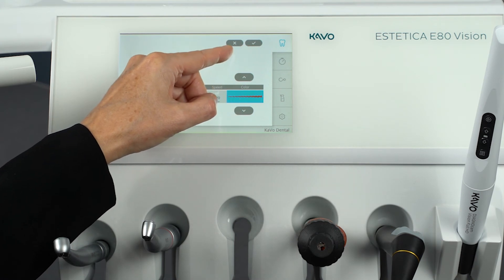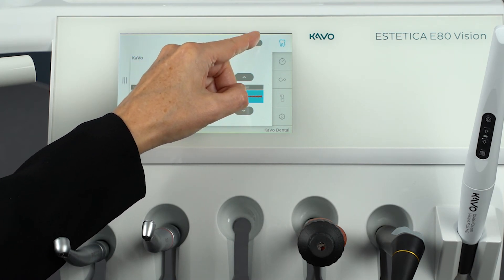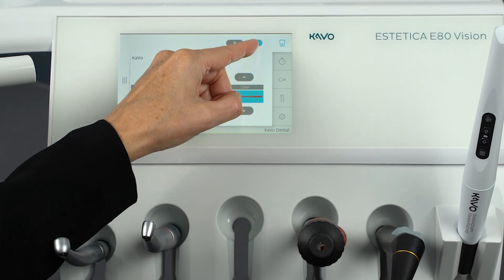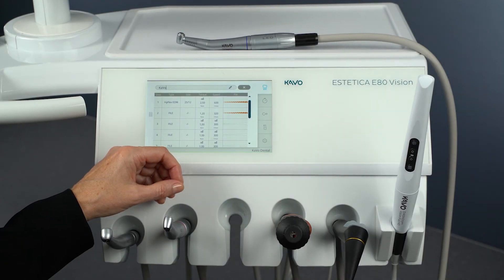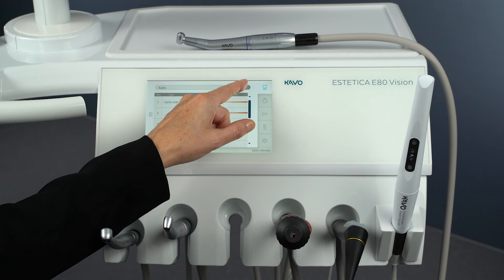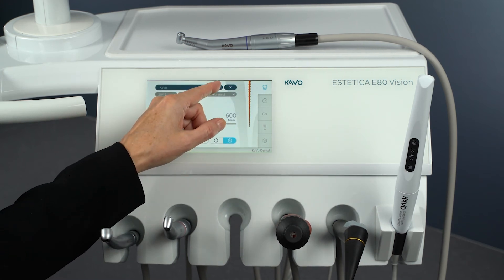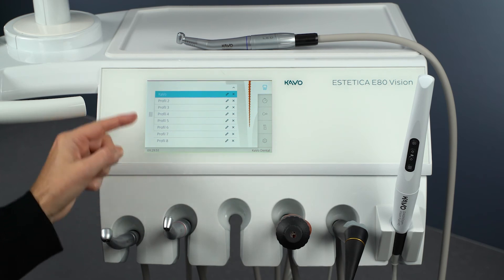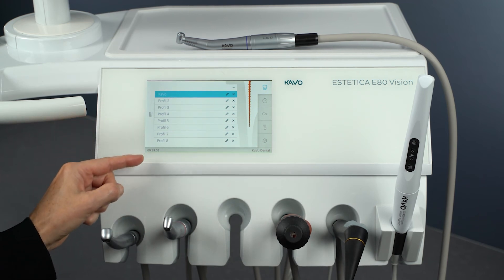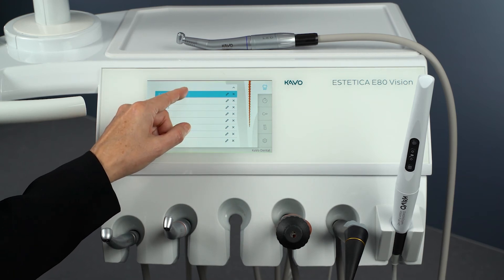The process can be aborted with the Cancel button. Close the file editor and open the Profile Selection pop-up menu. The selection list of file profiles is displayed. Tap on the desired file profile — here KaVo is used as an example.